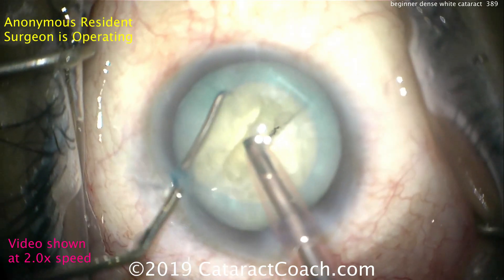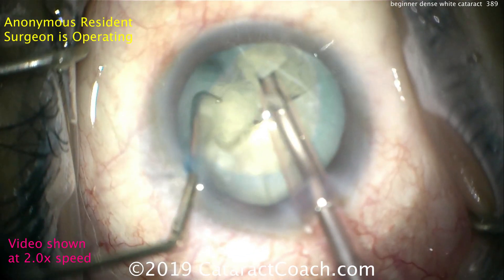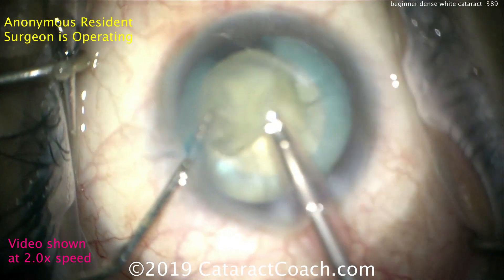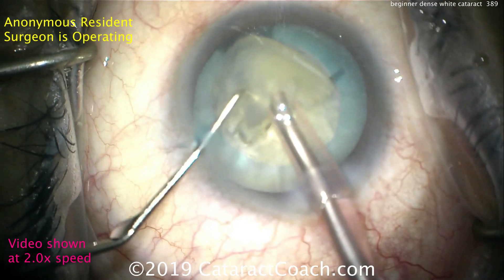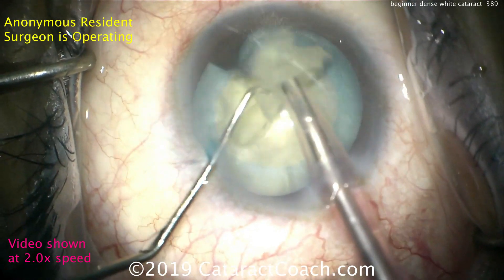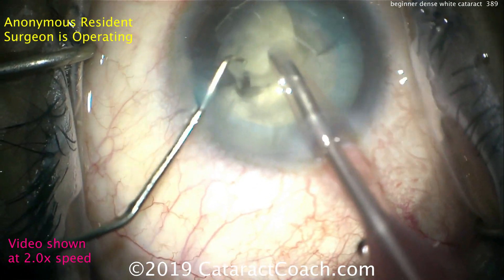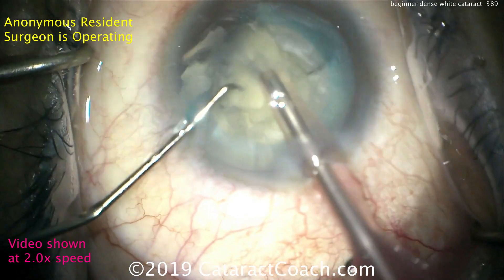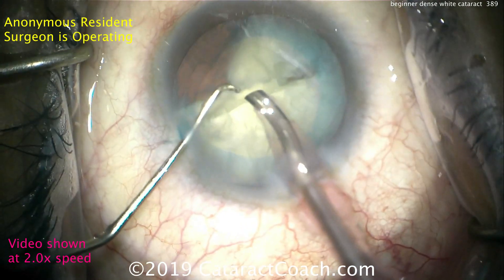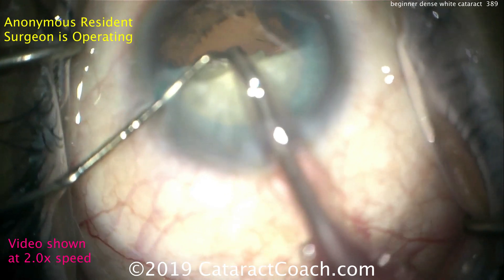The chopper is going around this — looks like we're going to do a horizontal chop, break off a little piece. Rotate it again and buzz the probe in. That's another good chop. Now the technique here is quite good. If this really is a resident who has done only 50 cases or so, I'm really impressed. The surgeon is able to use the chopper and do a horizontal chop to bring out these pieces and fully separate them, getting the first hemi-nucleus removed.